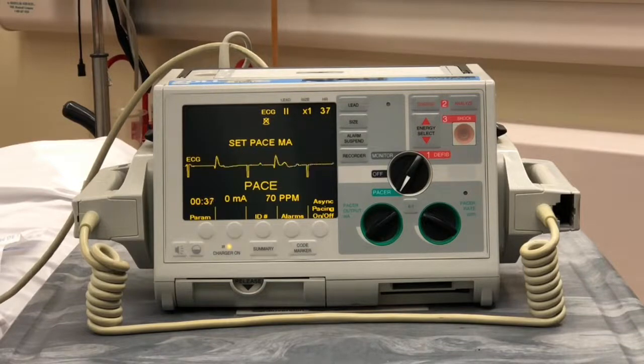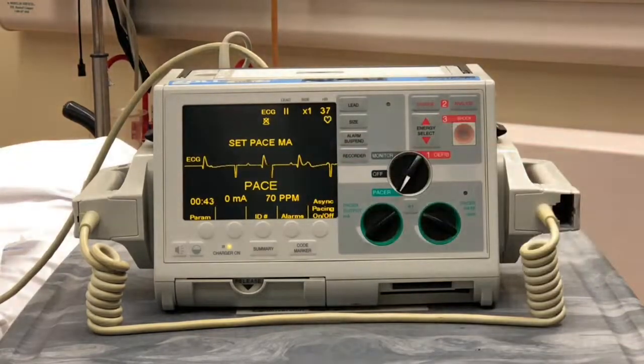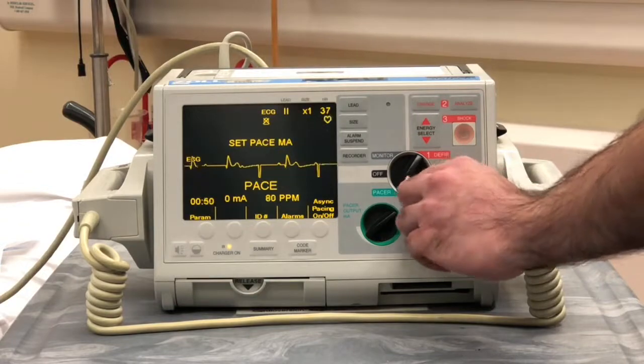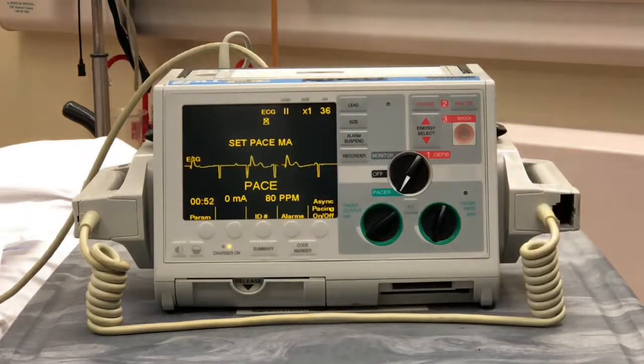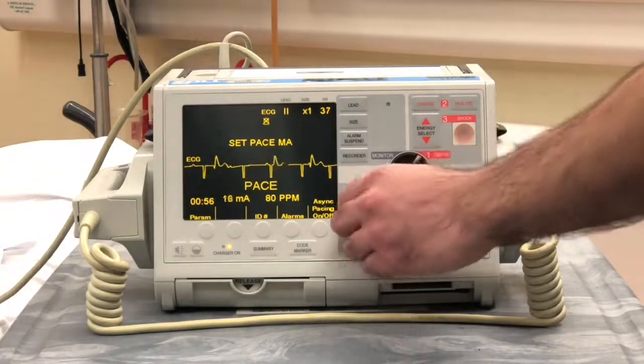Our defibrillator is set to a default of 70. Our physician is ordering a rate of 80. So we're going to turn up the rate to 80. And we are going to dial up our MA until we achieve capture.